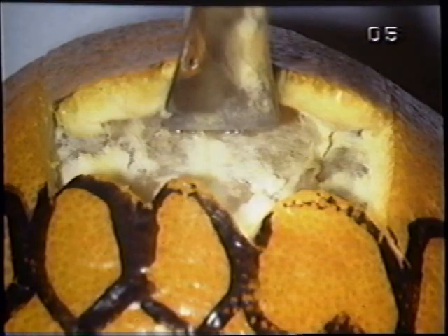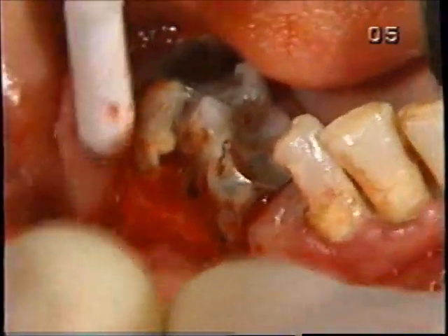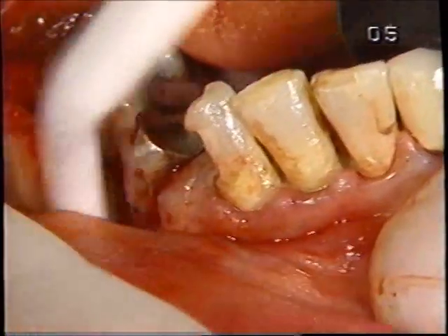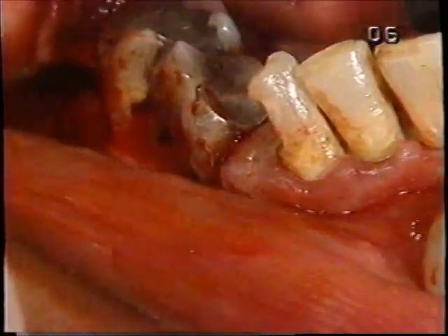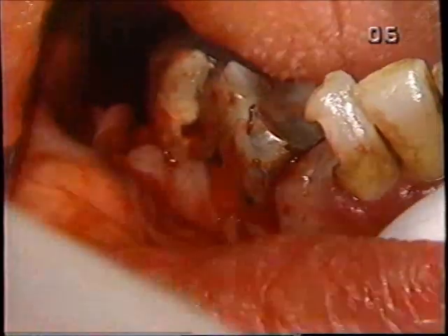But in reality, it's no more difficult than peeling an orange. Here, as you can see, peeling it gives you access to where you need to be. It's the same in the mouth. Make the incisions, reflect the flaps, put them back when you're done, and it gives you access and availability to the surgical site in a way that limits bleeding and allows you to expedite the surgical procedure.